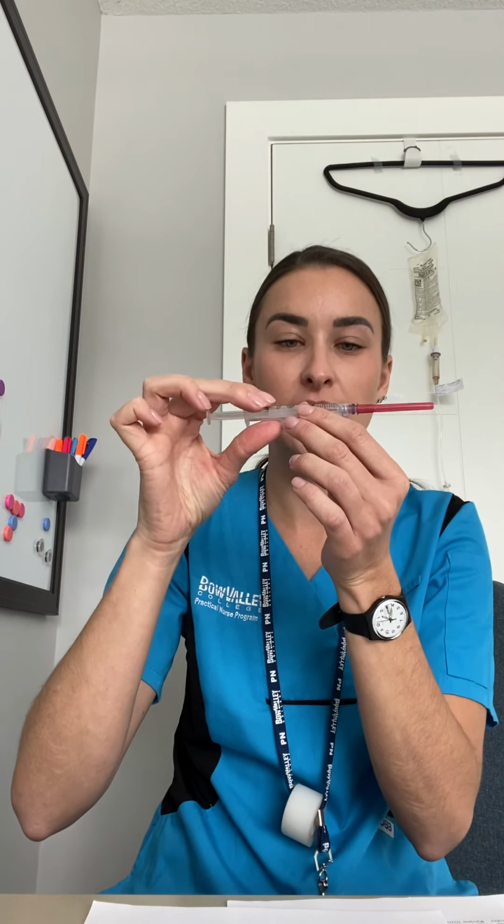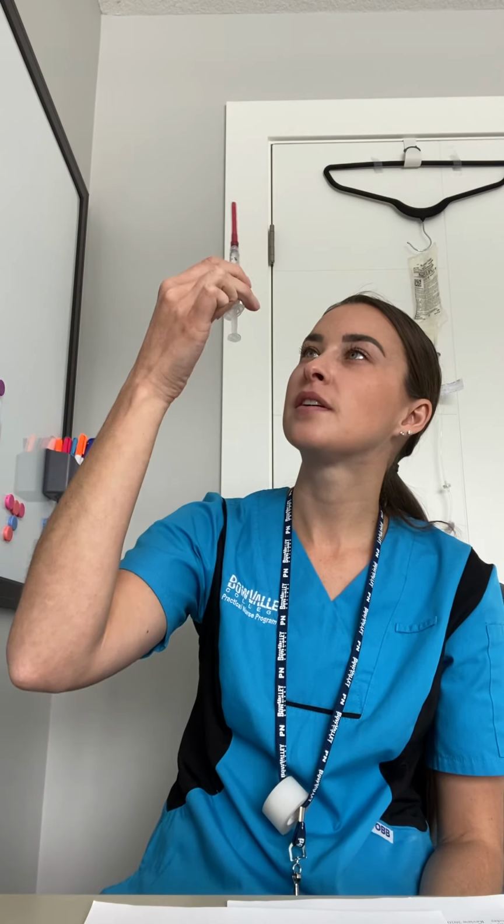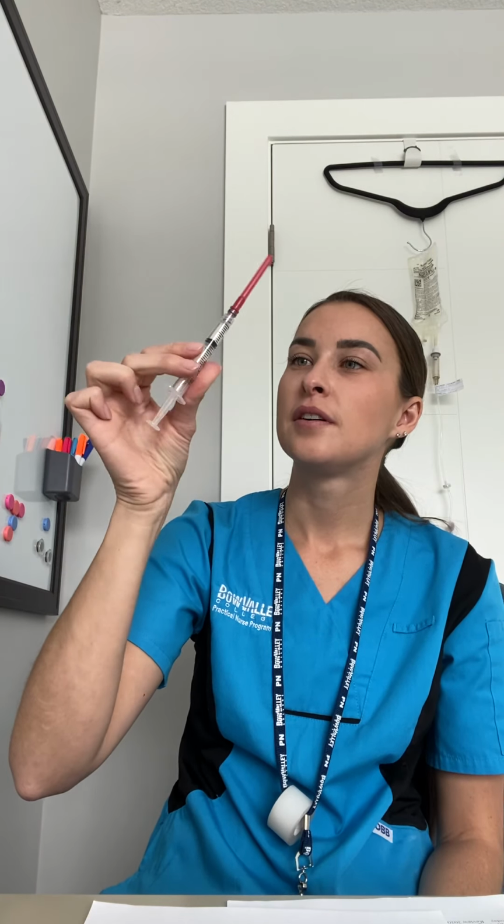Okay, there we go. Oh, maybe not quite. One more. Still have a bubble there. Come on. Okay, can you see this now? And we have 1 ml there.